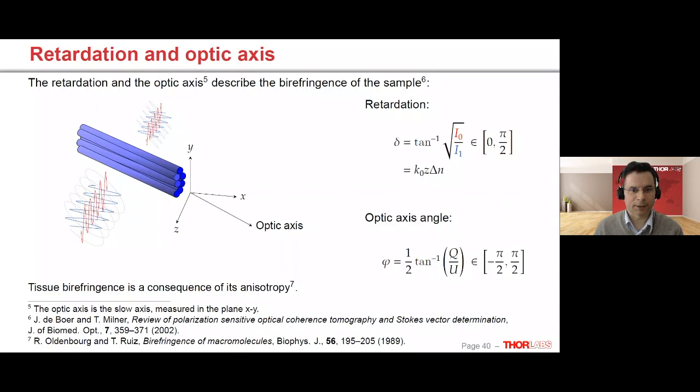And collagen tends to adopt many different configurations, and maybe you need to stretch the sample to make it clear, or in some positions there is a clear direction, and then it can be measured without stretching the sample, without making forces.